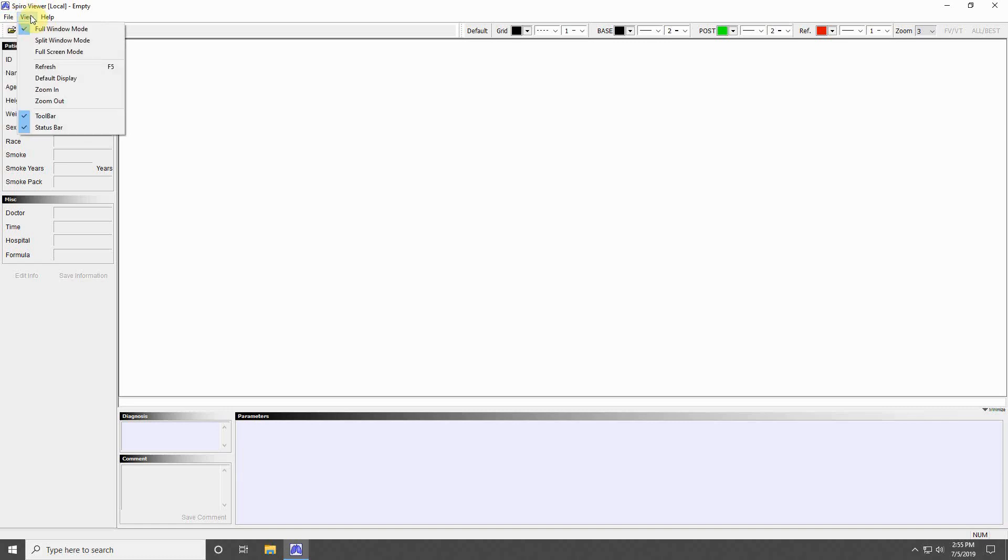The View menu allows you to customize how you view your data or program. The first three options allow for screen layout of your data.